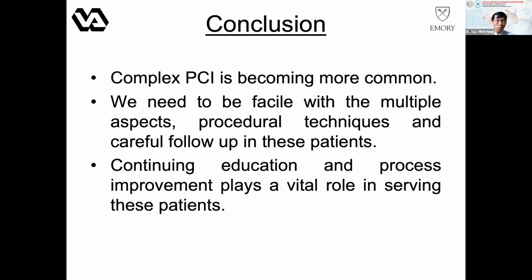Yeah, thank you. Gautam, the stent design. Is there any difference between choosing this stent over that stent in affecting procedure success? Because nowadays we see a lot of improvement in stent technology. We have thinner stents, and we have a lot of advantages in the flexibility and the pushability of stents. So how is your own experience in choosing stents for complex PCI?